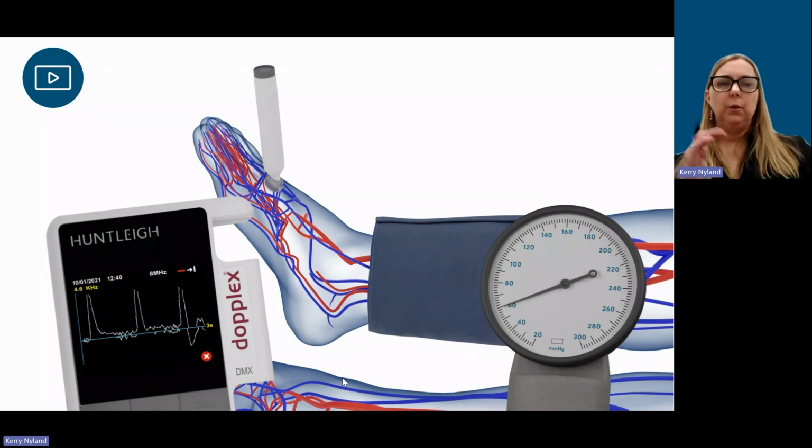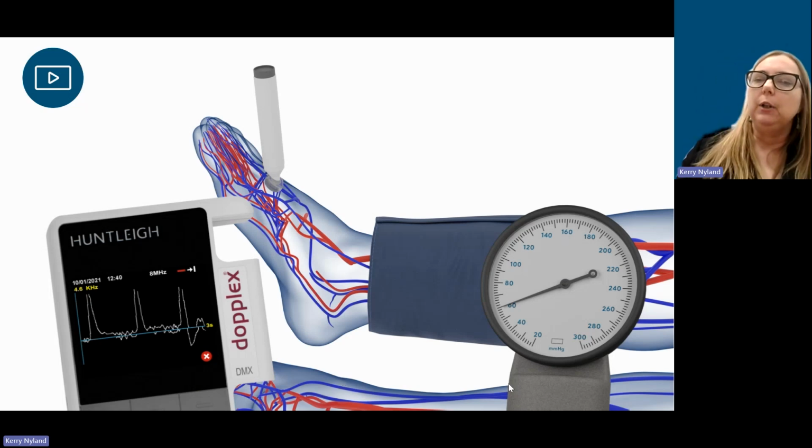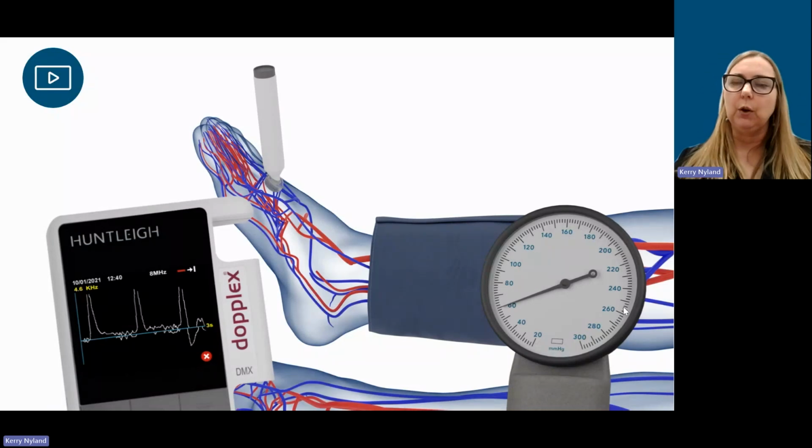Okay, so if you're on the dorsalis pedis on top of the foot, it can be very easy to slip with the probe and miss that sound returning. So try and anchor your hand as much as possible to prevent that happening. Once you've done it a few times, you'll get used to your own way of doing it and where you position yourself. You can also put the cuff on upside down if you want to, so that the tubing is going up the leg, and that can stop you getting too much gel in the way of the tubing. So yeah, just another little tip there.